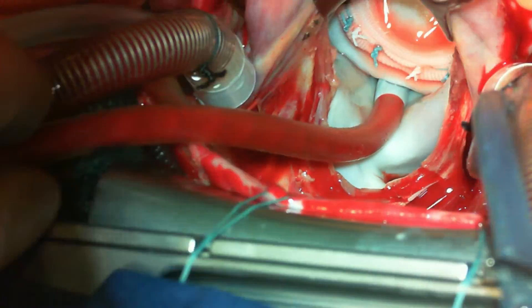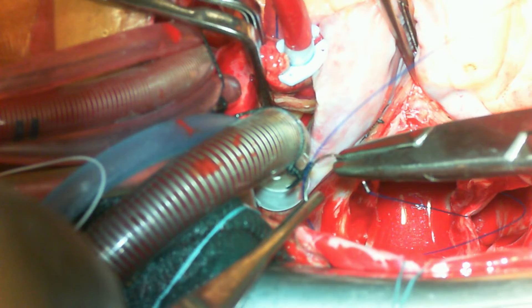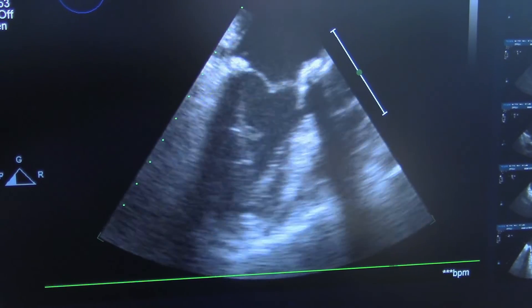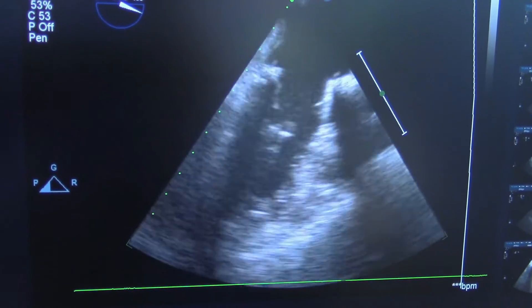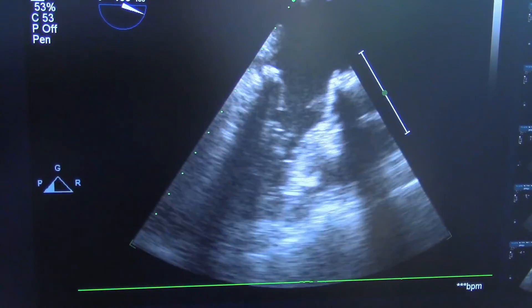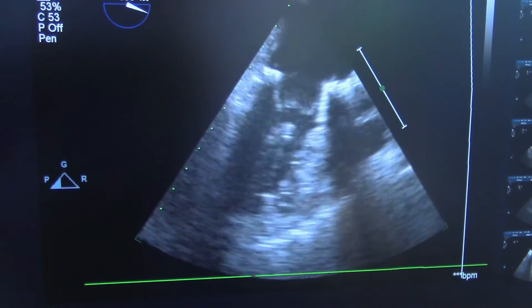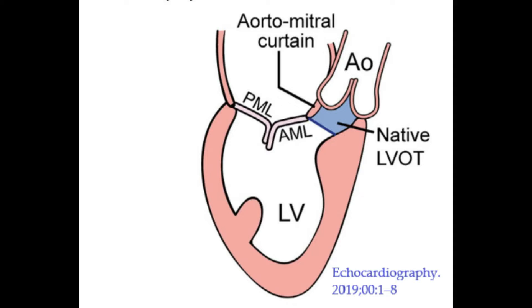This is what we have done here. It can be confirmed on TEE after the heart starts beating or after the cross-clamp is released. If you find that there is LVOT obstruction after bioprosthetic mitral valve replacement, the only other option is to either remove the valve and replace it or reposition it. In some cases, there are reports of alcohol septal ablation to reduce the size of the septum. One has to understand that the aortomitral curtain and the septum of the left ventricle are in a posterior and anterior relationship with regards to the LVOT.